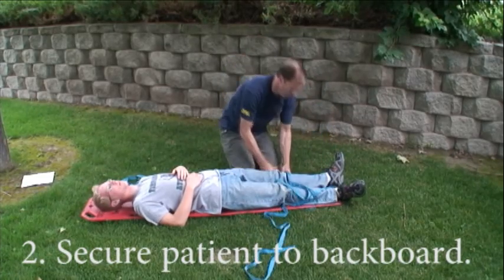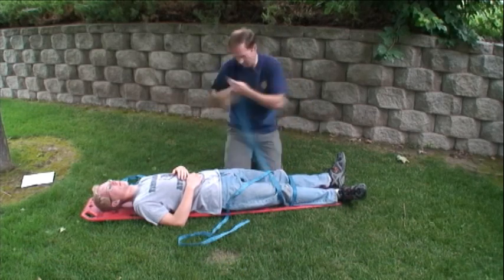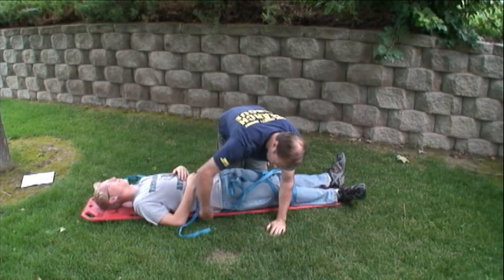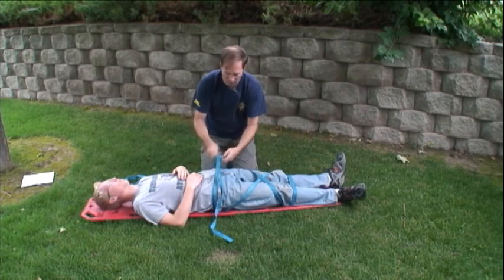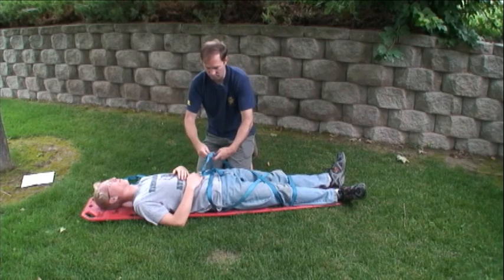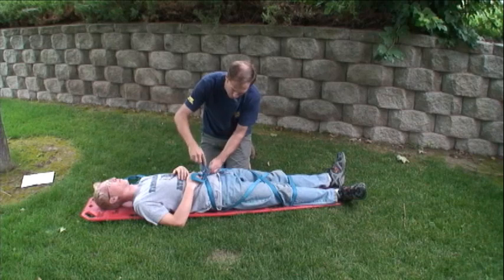Securing the legs this way will prevent your patient from being ejected through the bottom of the board. Go through the board, cross over, back through, and tie off. Here I did a water knot, but it's hard to cinch up water knots in this case, so maybe a square knot with overhand finishing knots would work better.